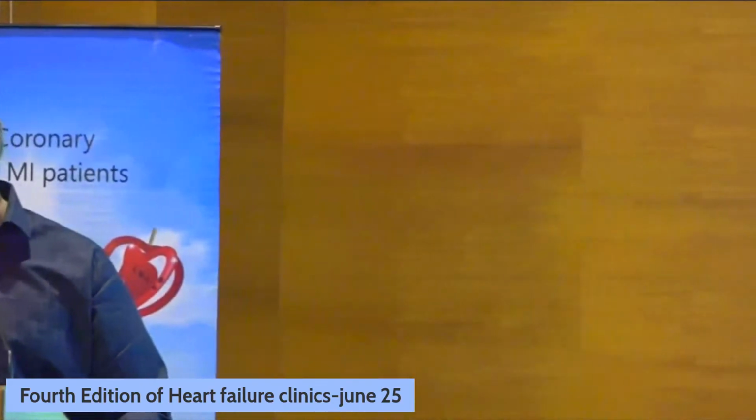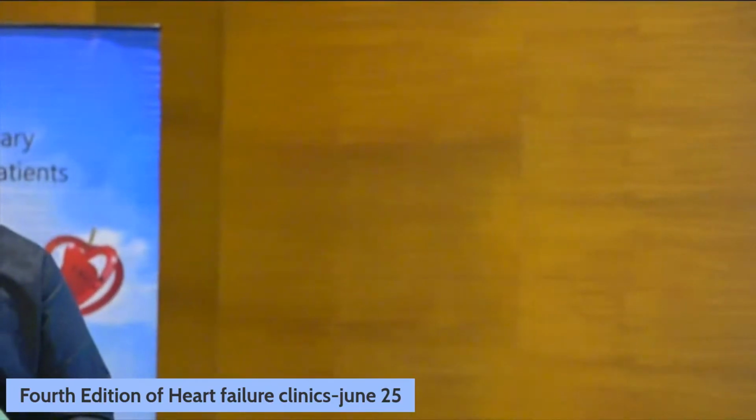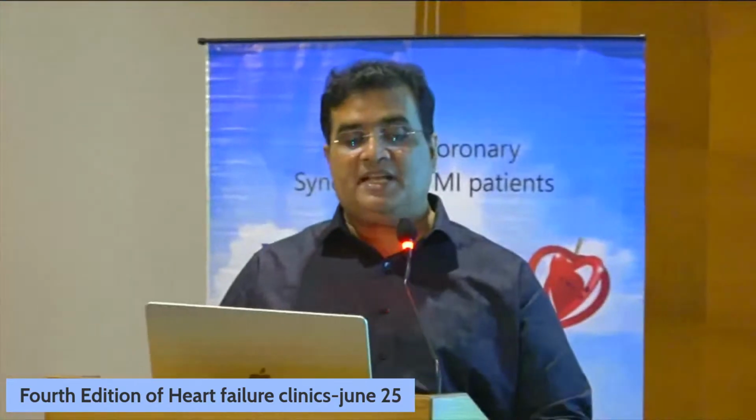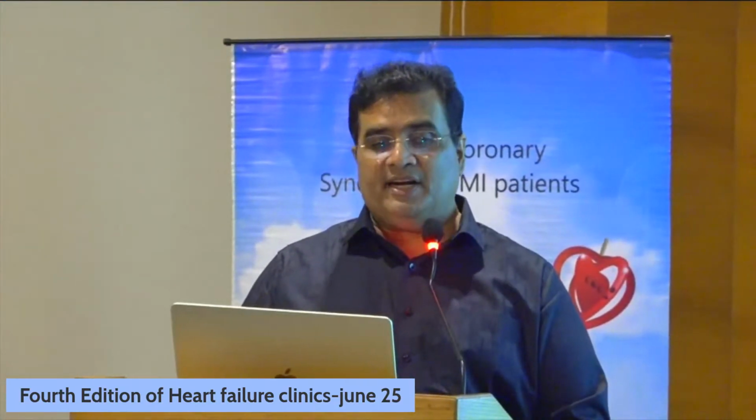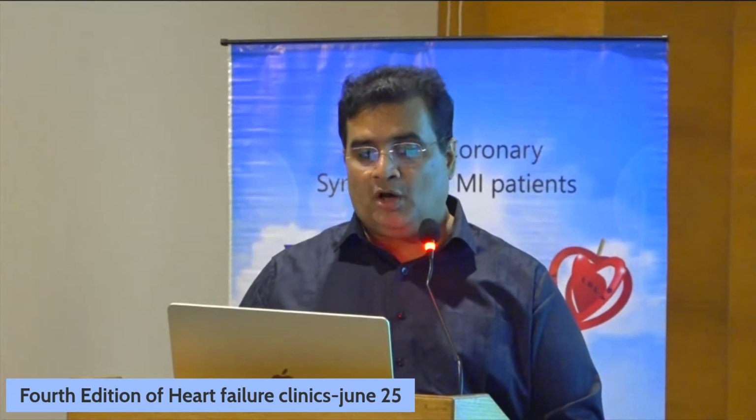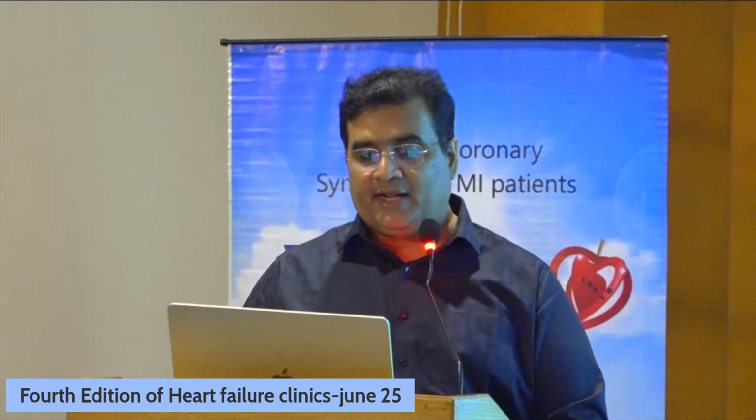For example, if we do a stress echocardiography and the stress echo is normal, that means the annual cardiac event rate is very, very low. The advantage of echo is obviously no radiation, as I told you. And apart from the left ventricle, we can look at the walls, we can look at the right ventricle, we can assess the filling pressures, which are not possible with other modalities like CT or MRI.